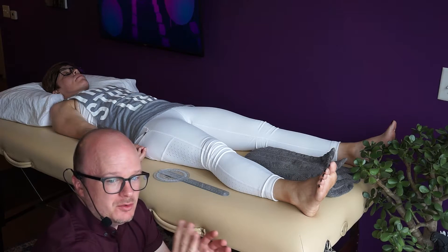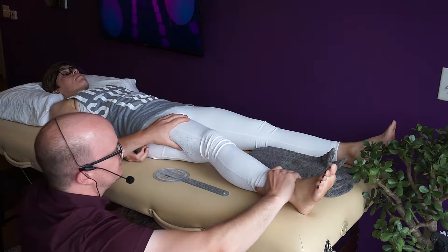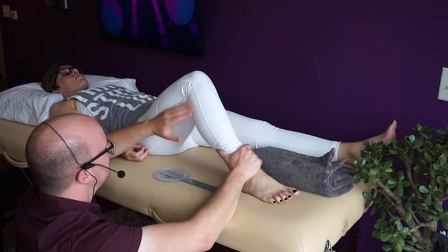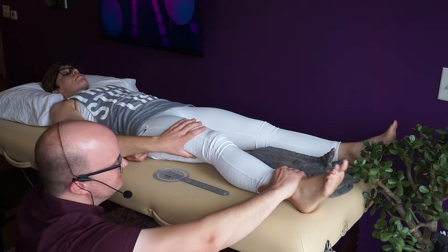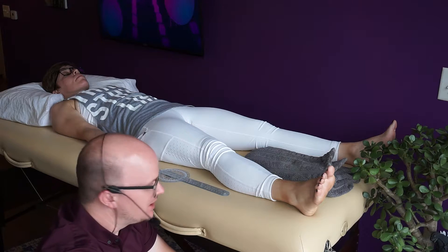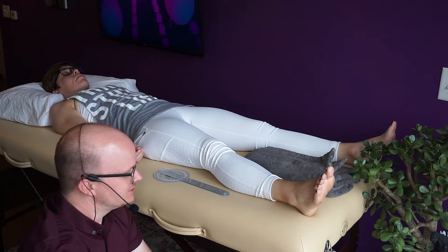The fourth end feel is the one we definitely don't want to find, and that's empty. An empty end feel means there's pain — say she's flexing her knee and I'm pushing passively, she says 'ow,' there's nothing stretching, nothing approximating, no hard end feel — just pain. That means we definitely need to treat that. If you find a hard end feel where there shouldn't be, that means there's bone growth that shouldn't be there and you need to talk to the doctor.